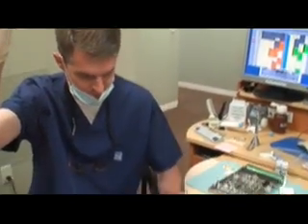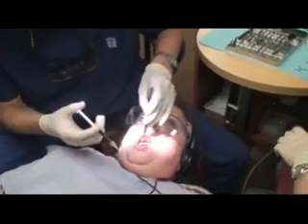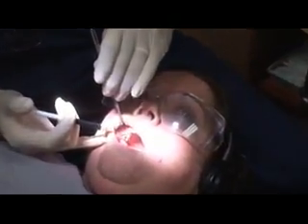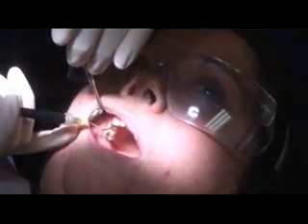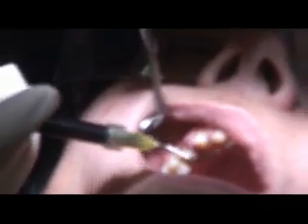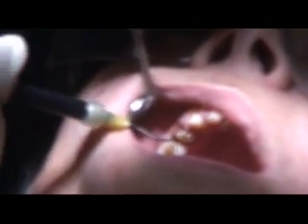I'll just go through and explain it bit by bit. Watch closely. We use Viscostat quite a bit here in our office. I have one rule I want everybody to be aware of, and that is you never put a cord into a bleeding sulcus. If you can remember that, life will go well for you when you pack cord. We're first of all going to rinse a little bit. We want to make sure that we can stop the bleeding first, and if the Viscostat doesn't have a lot of little black pieces of coagulated blood, then we're probably doing well. We've got good control of the bleeding.